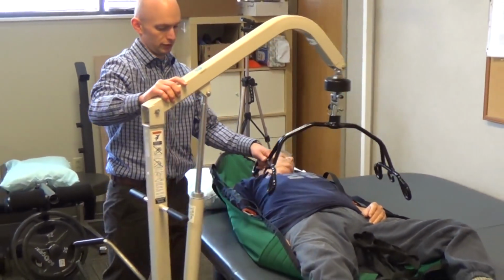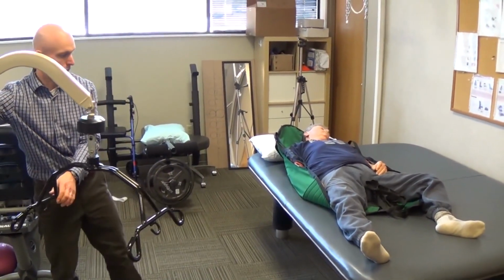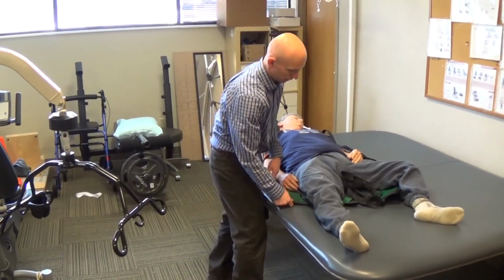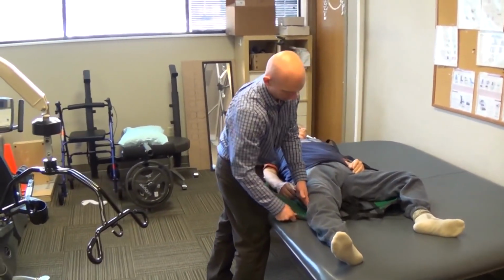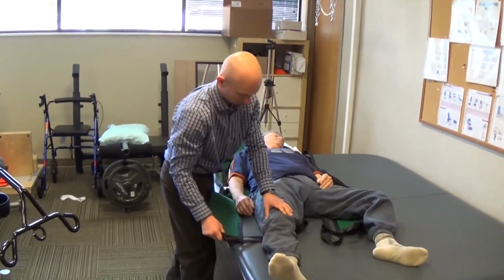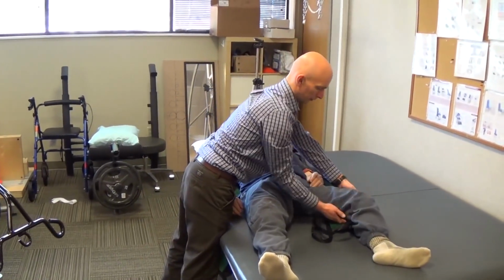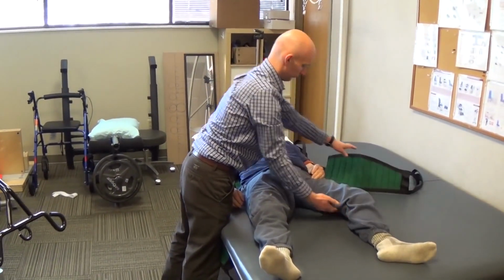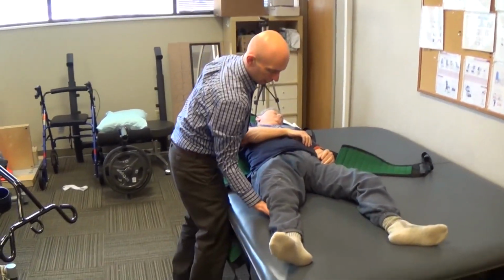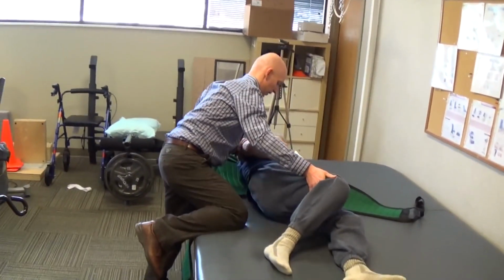Unhooking the straps, and then moving the lift away. To remove the straps, just sliding it out from underneath the person's legs. Moving an arm, helping them bend the leg. And turn to the side.